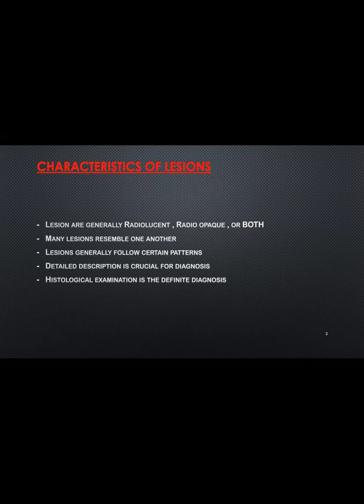When all these lesions fall into these two categories, many of them start resembling one another, and it could be tricky to properly diagnose a lesion based on an X-ray or even clinical diagnosis only. So a detailed description is crucial when we're communicating with the pathologist, because at the end of the day, a histological examination is always the most definite diagnosis.